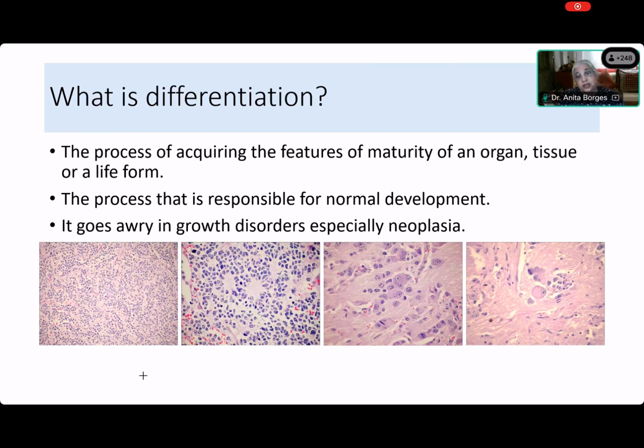Okay, Amrita, so tell me, what are these four pictures actually about? It's showing lots of differentiation from the first picture to the last picture. So the first picture is very differentiated, and this last picture is not differentiated. Is that what you're saying, Amrita? Yes, ma'am. And this picture that I'm showing you here is differentiated. Is that what you're saying? Yes, ma'am. Does everybody agree with her? Lalit, you agree with her? Yes, ma'am. I see. What about Navneet?